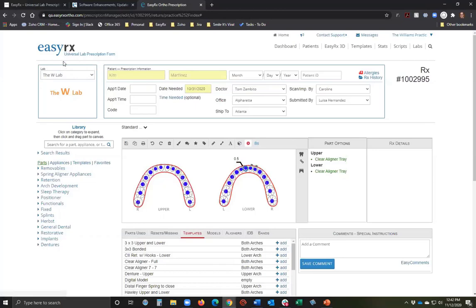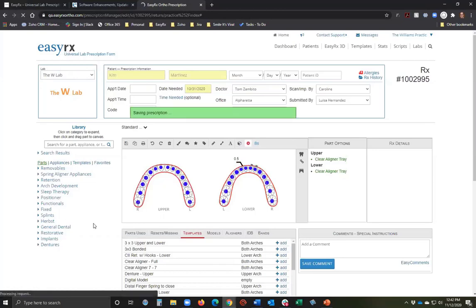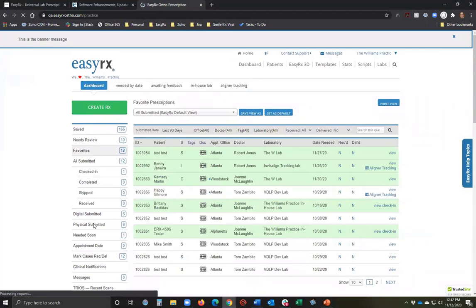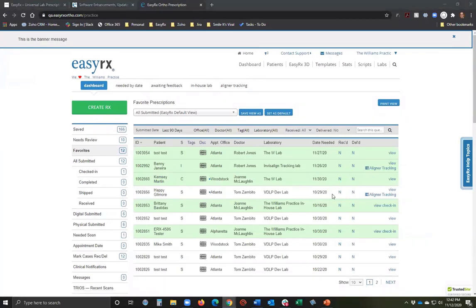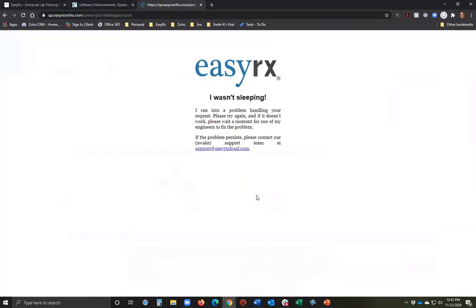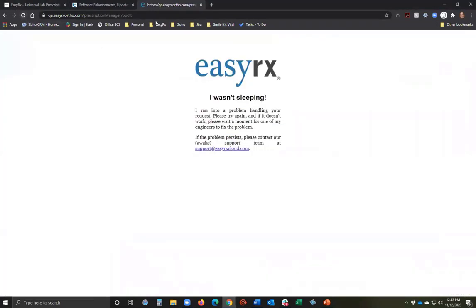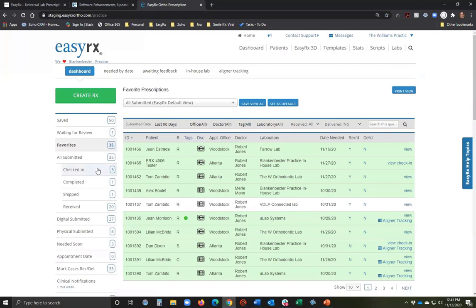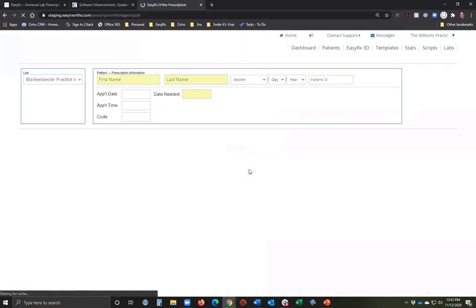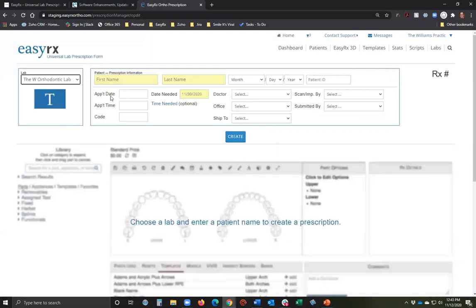Now let me jump to the lab management workflow. I thought I'd start on the practice side and then submit a case to an enterprise lab so you can see how that hangs together. I'm now logged in as a practice.